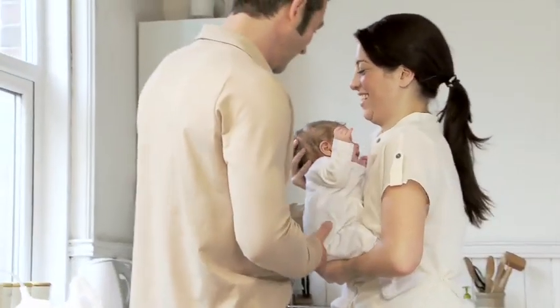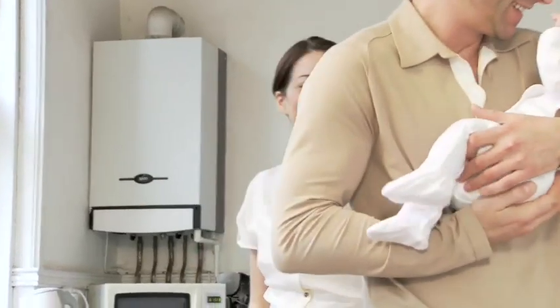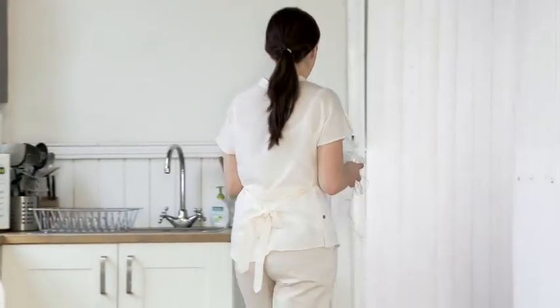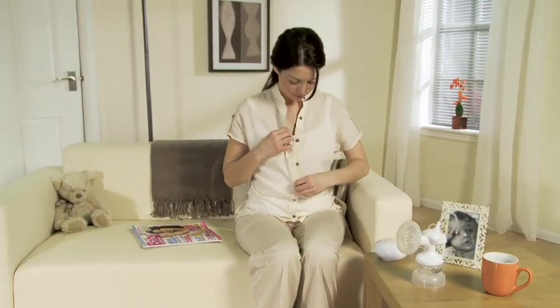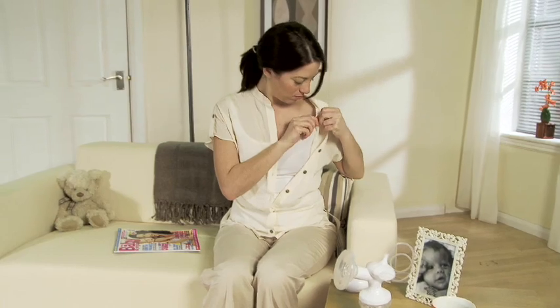Designed to mimic a baby's natural feeding action, the electric breast pump is best used in a relaxed and familiar setting. When you've found a spot to settle down, attach the cup to your breast and activate the pump. Remember to keep the bottle in a level position and not to cover the small vent with your hand.